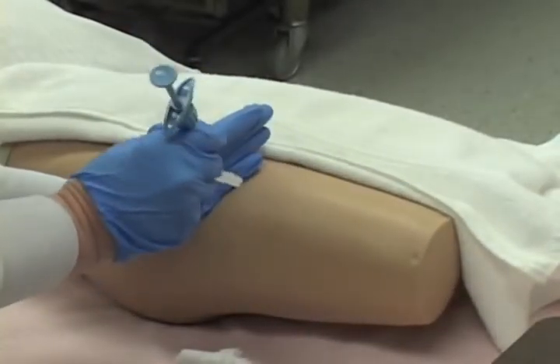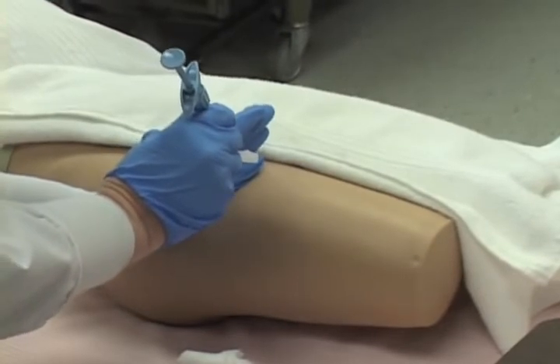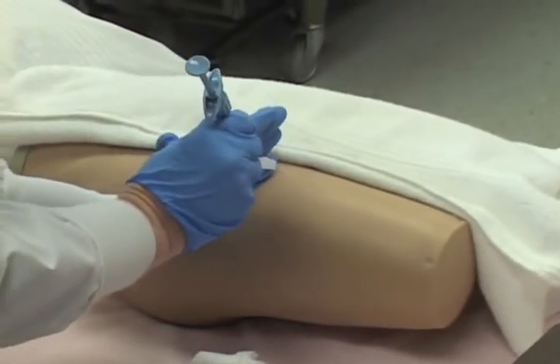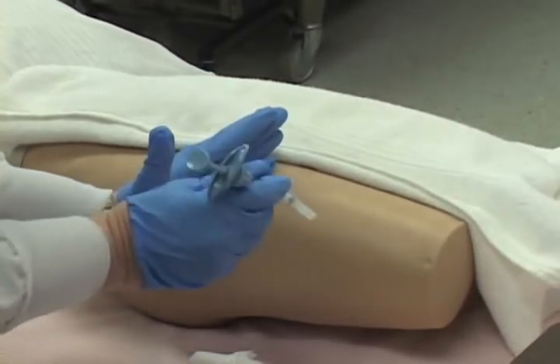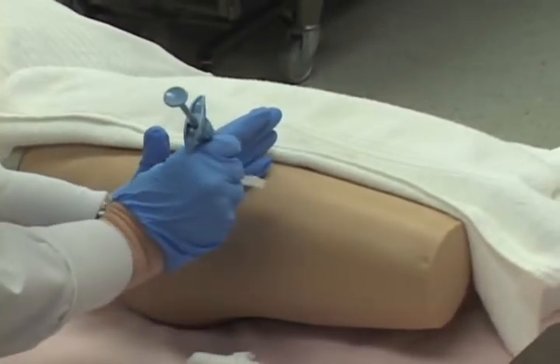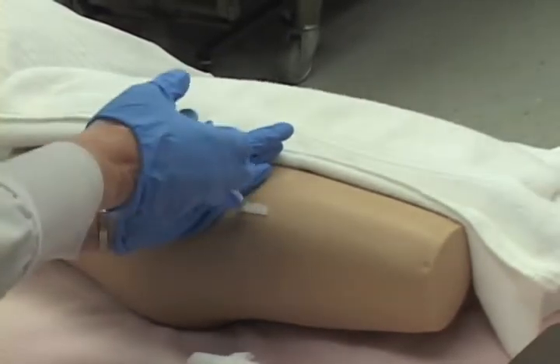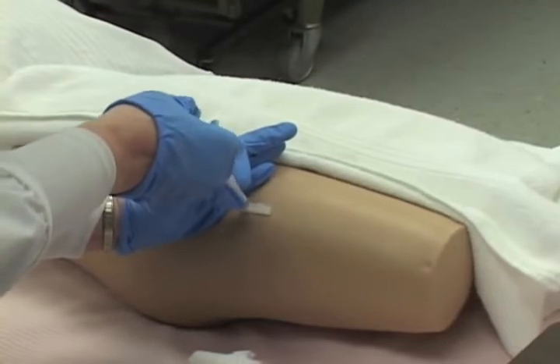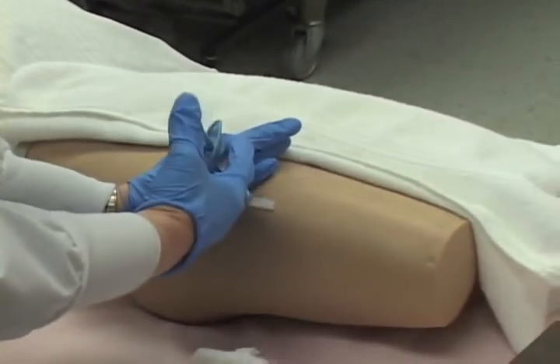Remove the needle cap without contaminating the needle. Do not allow the cap to fall into and remain in your patient's bed. Hold the syringe in your dominant hand between your thumb and your forefinger like a dart. Quickly dart the needle into the tissue at a 90-degree angle. While continuing to displace the skin with your non-dominant hand, aspirate by slowly pulling back on the plunger to determine whether the needle is in a blood vessel.